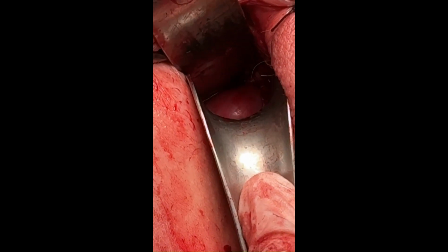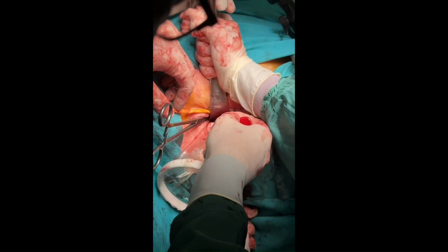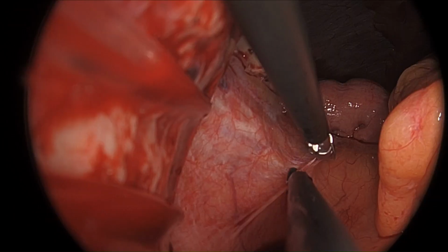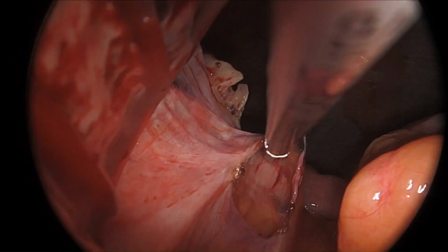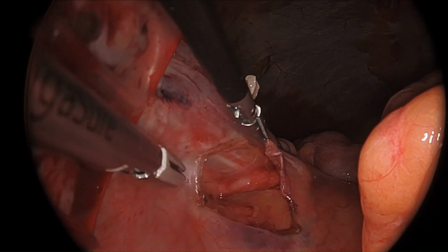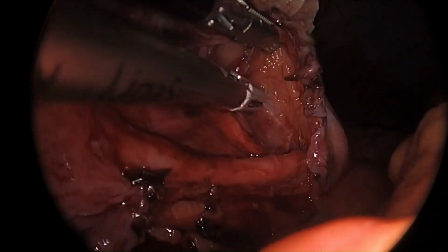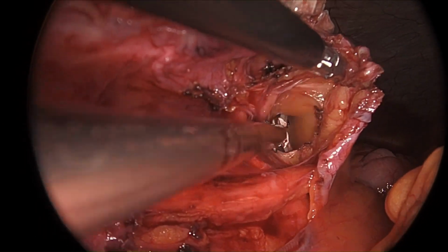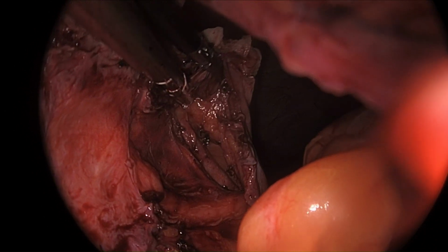The previously placed suture was opened. The surgeons entered into the abdominal cavity, and a vaginal platform was placed. The right pelvic peritoneum was incised, and the retroperitoneal space was entered. Ureteral dissection was started. The dissection of the retroperitoneal space was extended to reveal the main pelvic structures and marked on the screen.